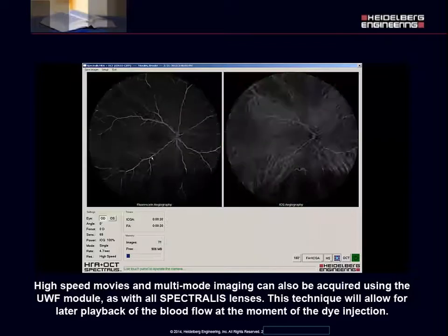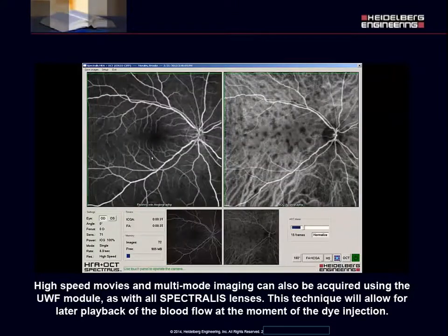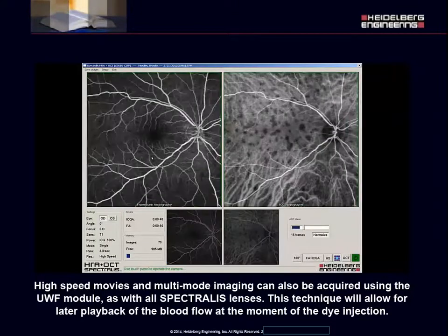High-speed movies and multi-mode imaging can also be acquired using the ultra-wide field module as with all Spectralis lenses. This technique will allow for later playback of the blood flow at the moment of the dye injection.